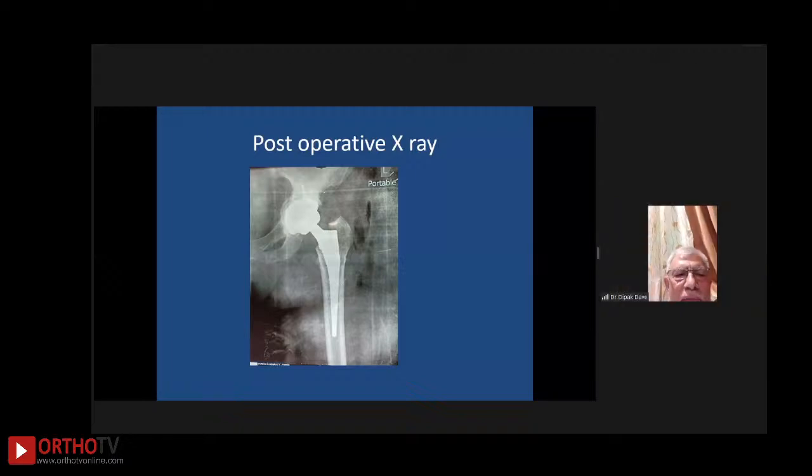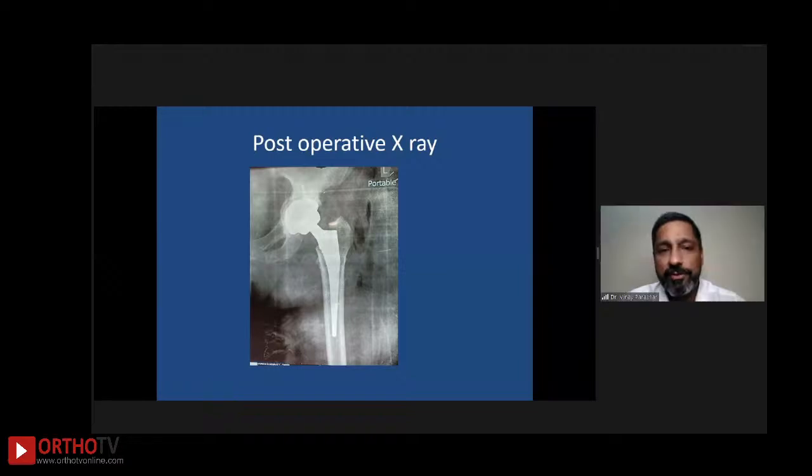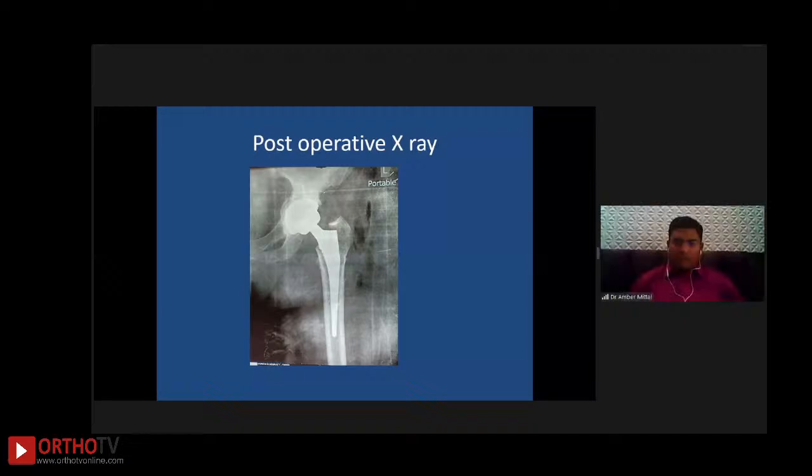I think Vinay, what would you think, that a different type of material, a continuum or gription, would be helpful, and a multi-hole? That would be another two added things. Very, very true, sir. Very true. And what was the age of the patient?